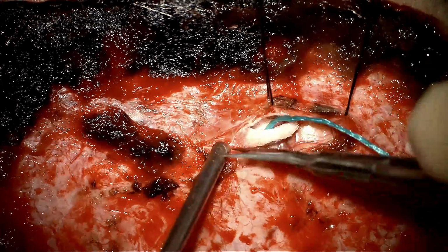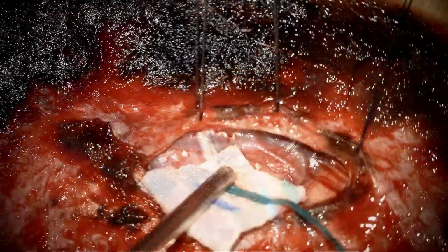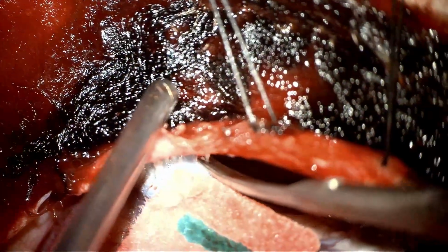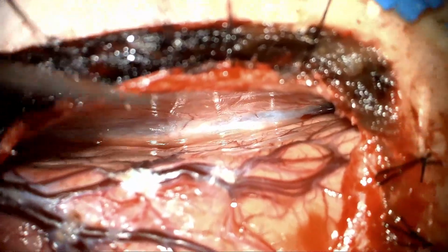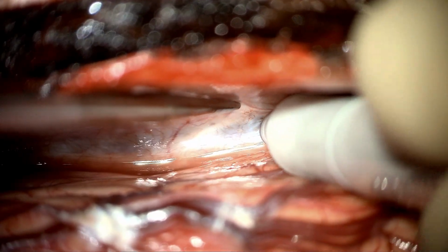We started the case by exposing the sinus, and a linear incision close to the sinus allows access while protecting the brain at the same time. Coagulation and cutting of these small bridging veins and sharp dissection of the arachnoid is key to access the interparietal corridor. Here we are mapping the sinus rectus.